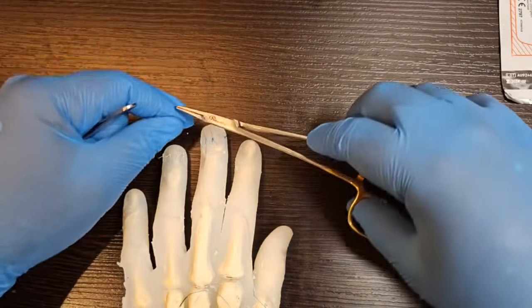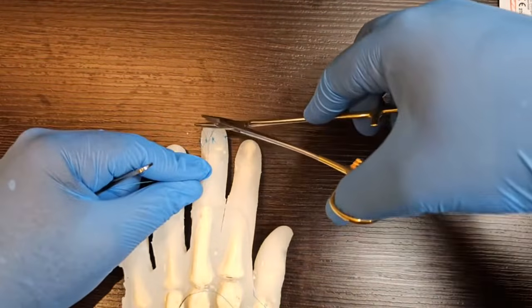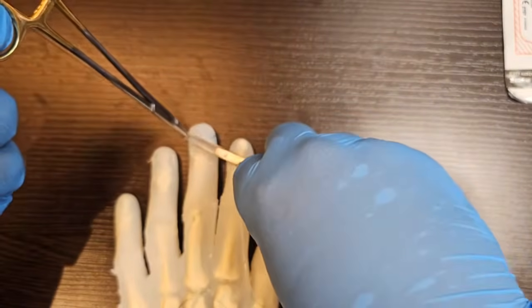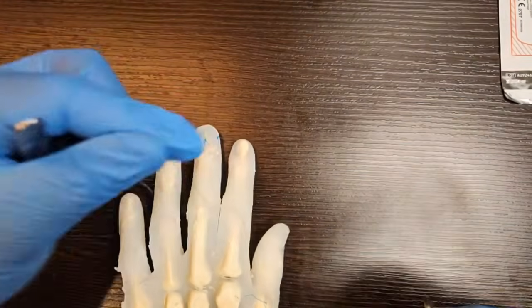So some will splint it, push, place, and rotate. Tie square knots. The single knot is the reef knot. The double throw is the surgeon's knot. So you can splint it heavily, but obviously there's a risk of displacement. The other option is to fire a K-wire axially through the finger.